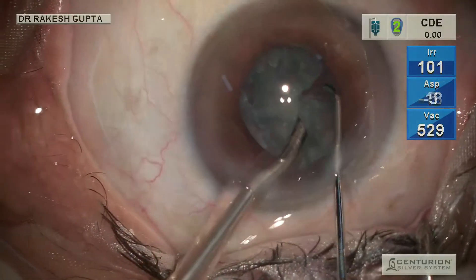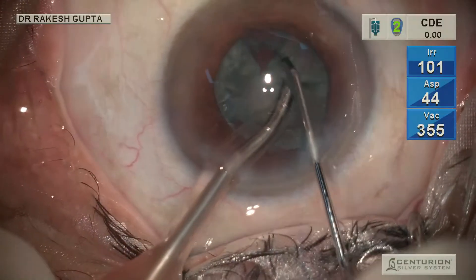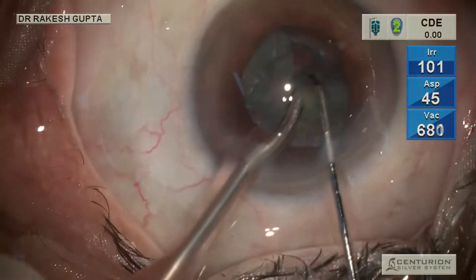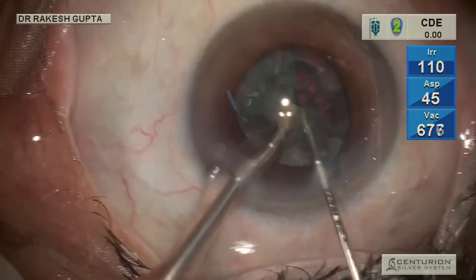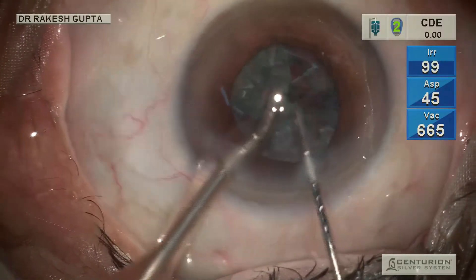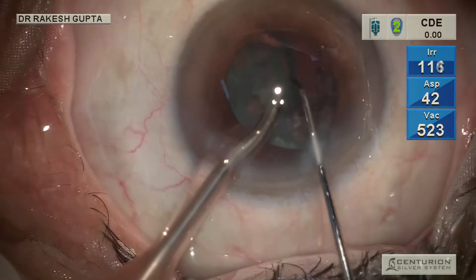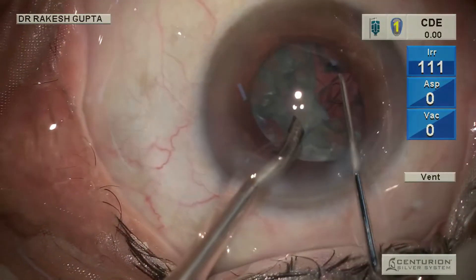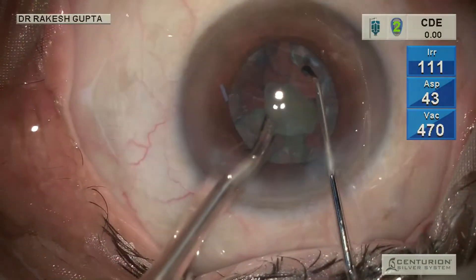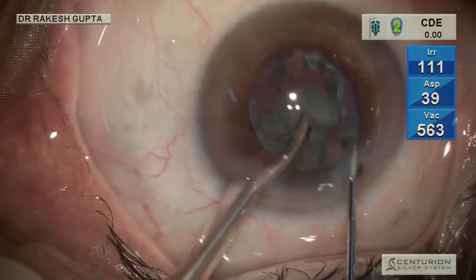Equatorial chopping has several advantages. You can see I am simply holding the nucleus with vacuum alone, and the counter-traction created by this equatorial chopper helps in chopping the nucleus. If the cataract is soft, it also helps in aspiration of nuclear fragments — if the cataract is soft up to grade one or two, you can actually aspirate the whole nucleus by feeding the pieces with this chopper.